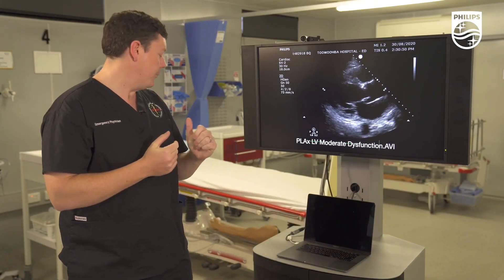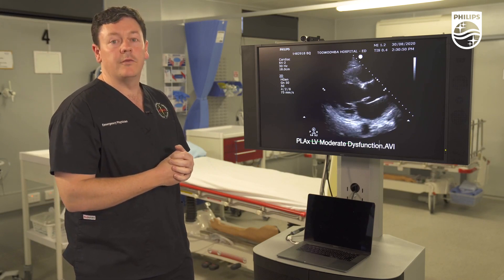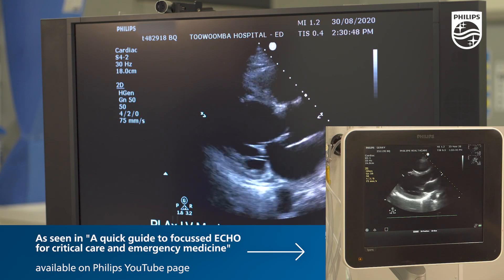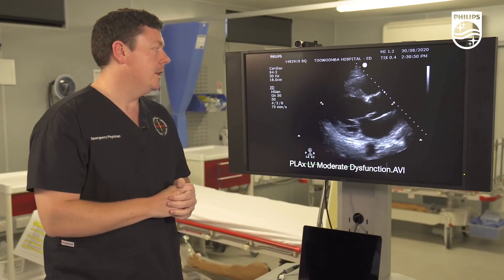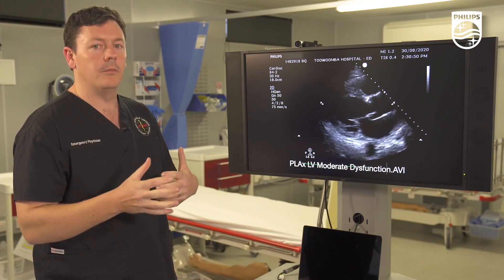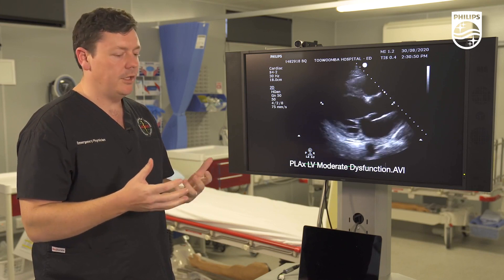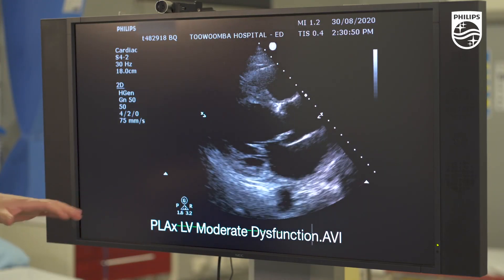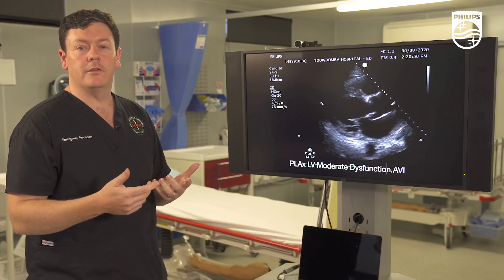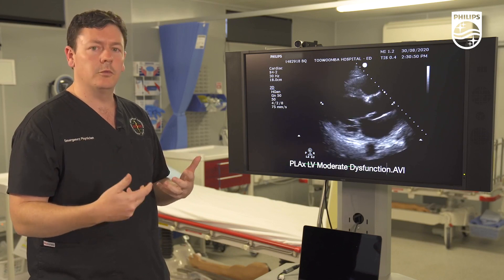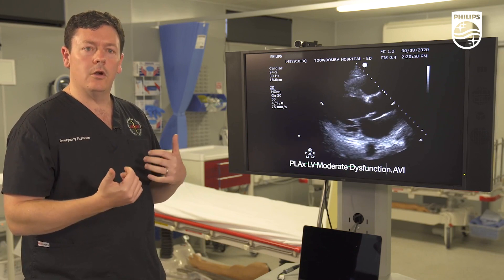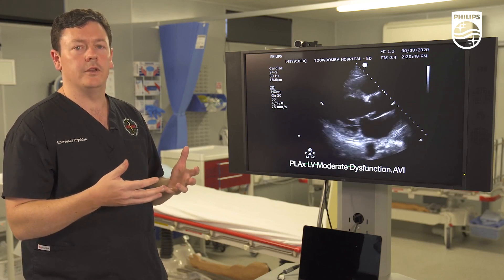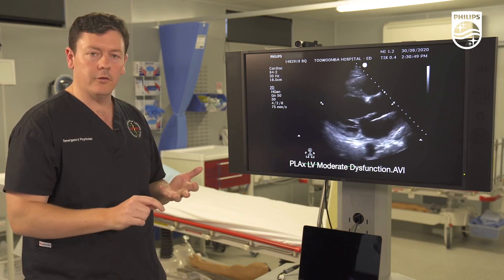The next question we're asking is about LV function in focused echo and life support. In the clinical scenario, the question is: is this patient's shock contributed to by left ventricular dysfunction? The key markers are looked at in 2D imaging. There is no specific window that's better than others — you want to look at all windows: subcostal four chamber, IVC, parasternal long, parasternal short, and apical four chamber, and synthesize that information to decide whether LV function is normal, mildly impaired, moderately impaired, or severely impaired.